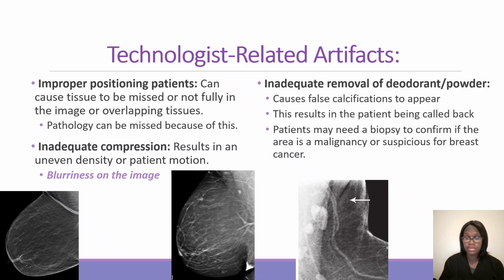This helps with the blurriness on the image. If I can apply a little bit more, maybe it'll help the image not come out with movement on it. So you can say something like that.